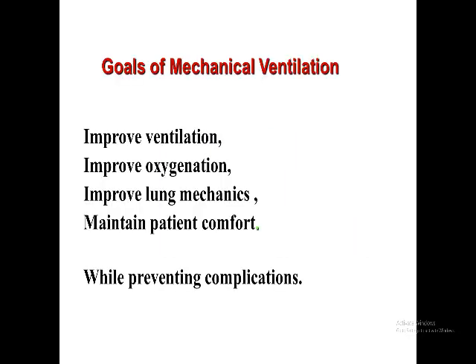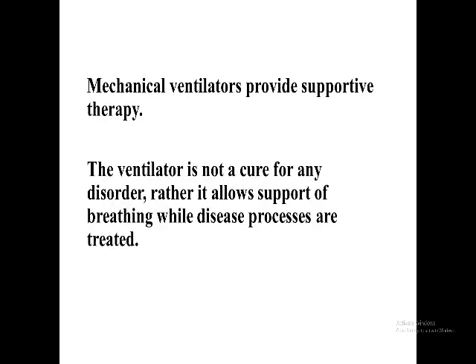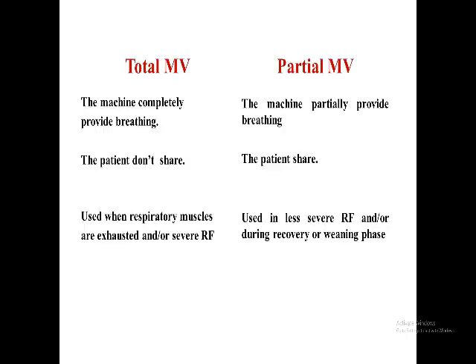Now we come to principles of mechanical ventilation. What are the goals of mechanical ventilation? Improve ventilation, improve oxygenation, improve lung mechanics, maintain patient comfort while preventing complications. Mechanical ventilators provide supportive therapy. The ventilator is not a cure for any disorder, rather it allows support of breathing while disease processes are treated.